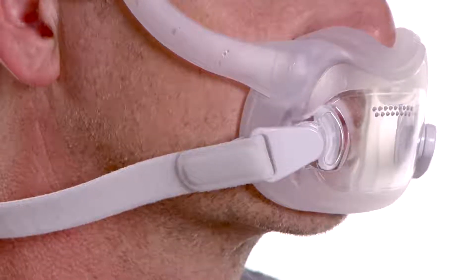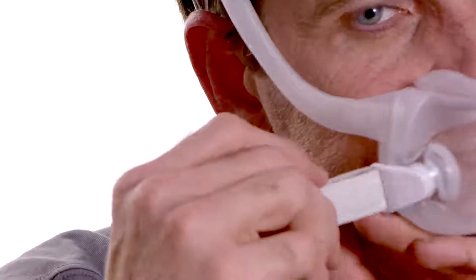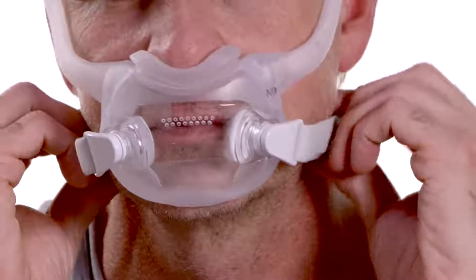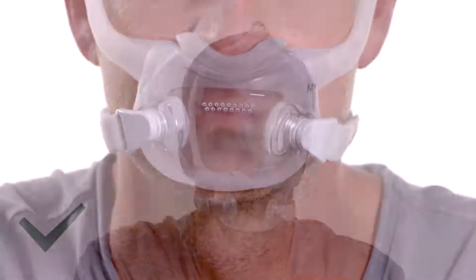To adjust the bottom straps, unfasten the Velcro on each side and gently separate the tabs. Adjust the length of the bottom straps until the mask fits comfortably and reattach the tabs. Be careful not to over-tighten, which may make skin bulge around the edges of the mask and cause redness or abrasions.